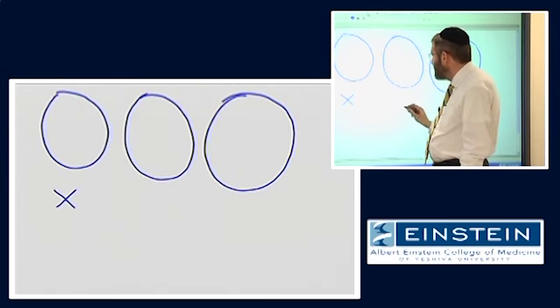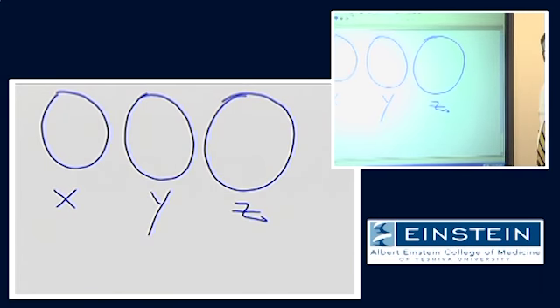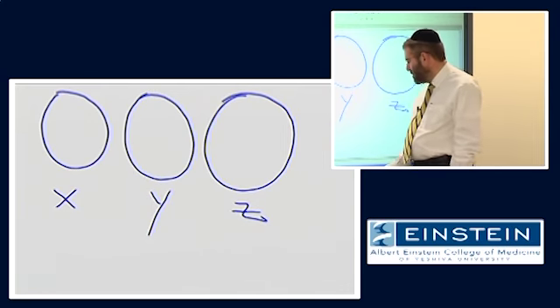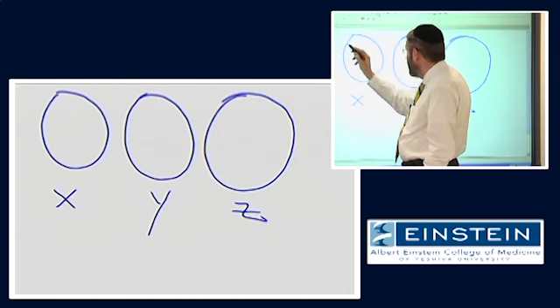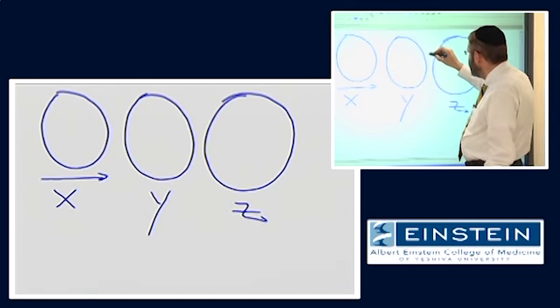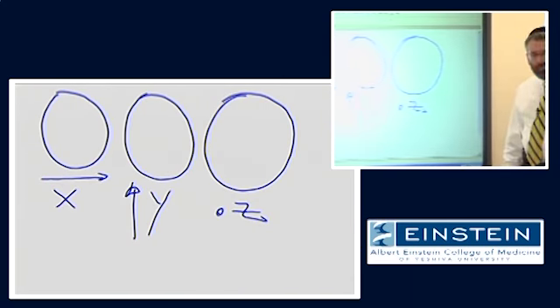and let's say we sensitize these images to diffusion, each in a different direction. In this case, each in an orthogonal direction. So in image number 1, the diffusion sensitization is on the x dimension, image number 2, the diffusion sensitization is in the y dimension, and this one is z coming out of the board.